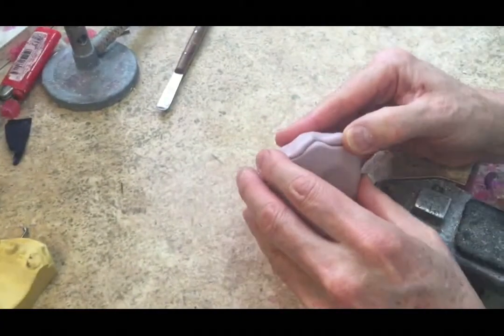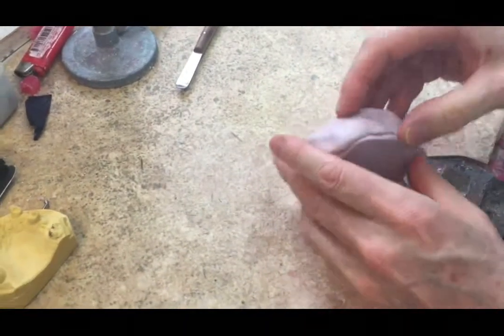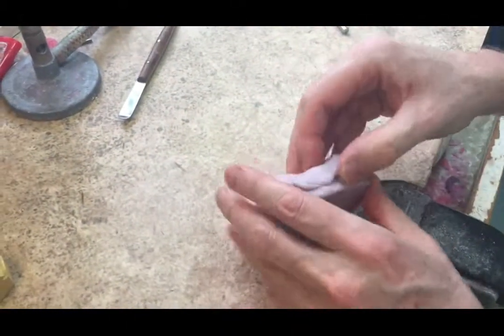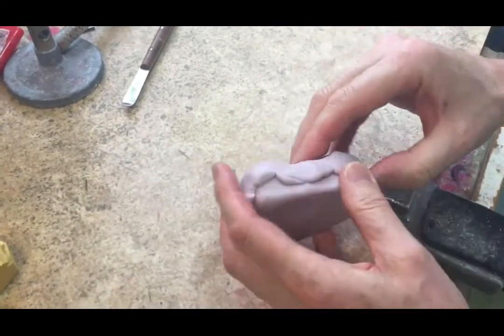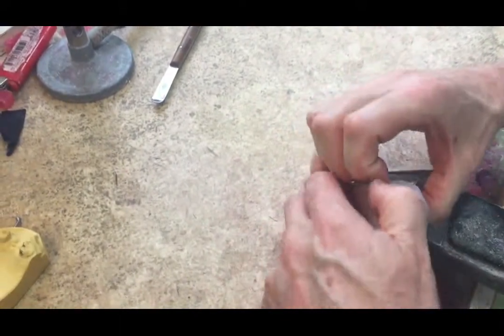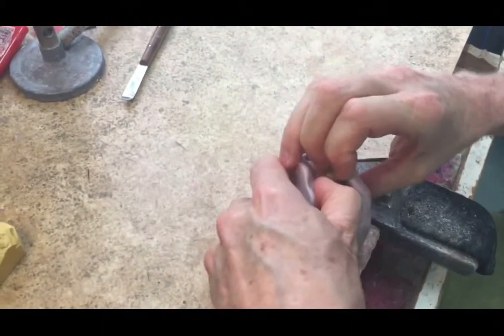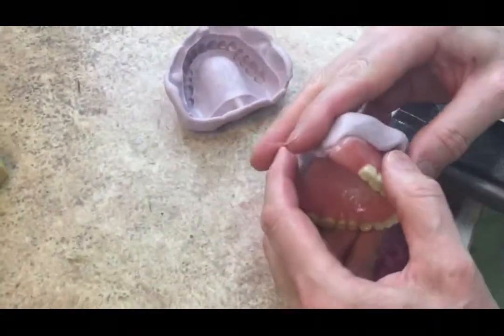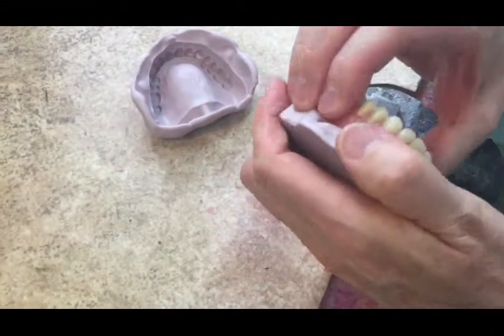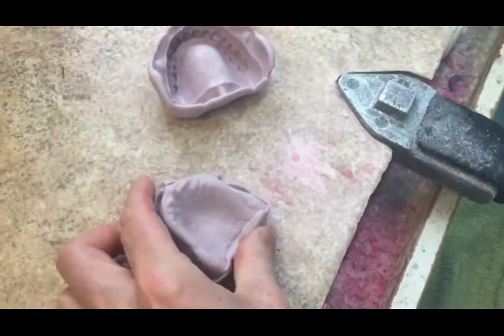What we're going to do now is take it apart carefully because we don't want to break the mold. There we have the teeth half of the denture, and there we have the model half.